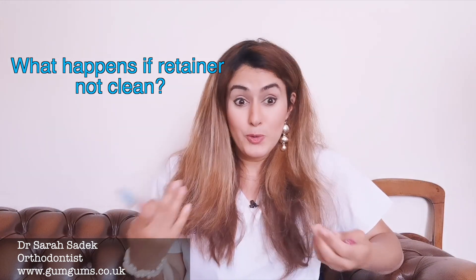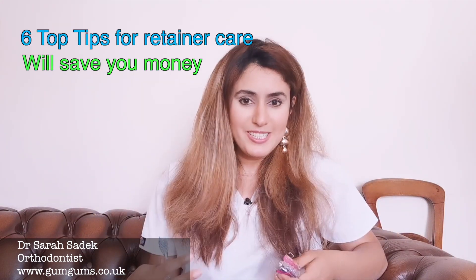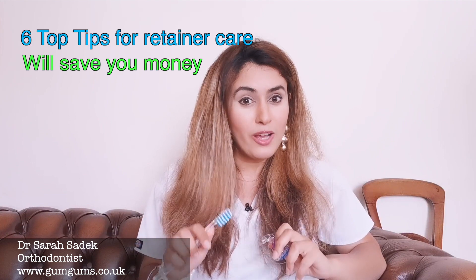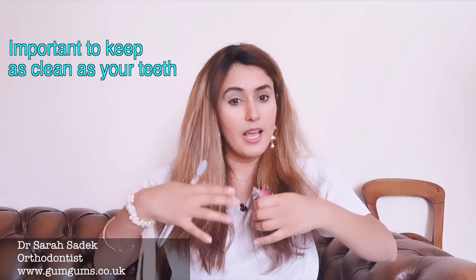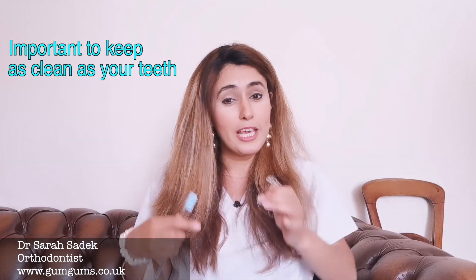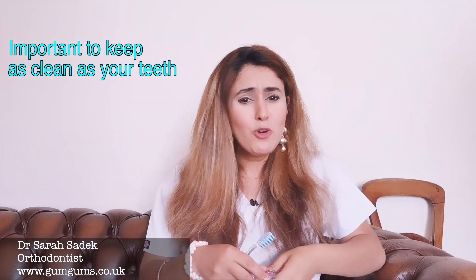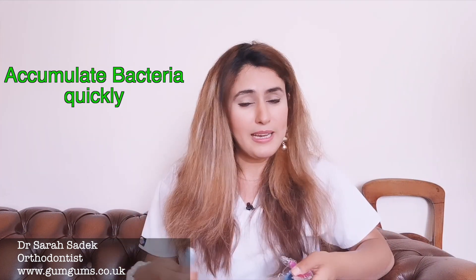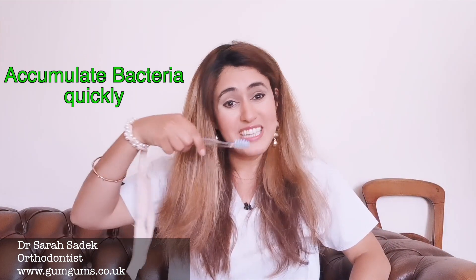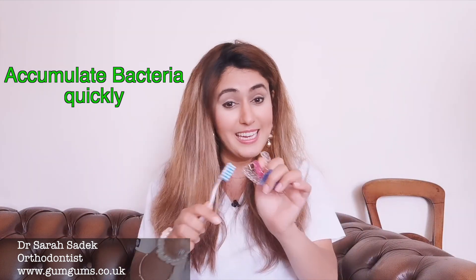What happens if I don't clean my retainer? At the end of this video I'll be sharing my six top tips on caring for your retainers to make them last longer, so make sure you keep watching right until the end. Retainers help the muscles and tissues in your mouth hold your teeth into their new positions. Just as it was crucial to keep your teeth clean during braces, it is equally important to keep your retainers clean. Your retainers sit inside your mouth against your teeth and can very quickly accumulate food, bacteria, plaque, and tartar. So just like you brush your teeth every day, it is equally important that you clean your retainers every day.